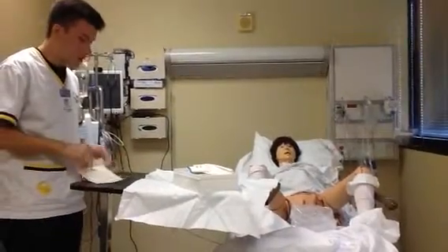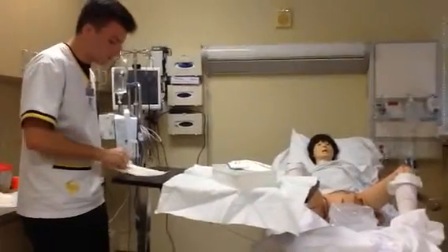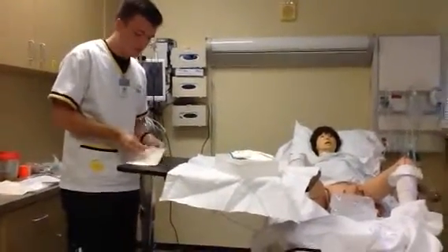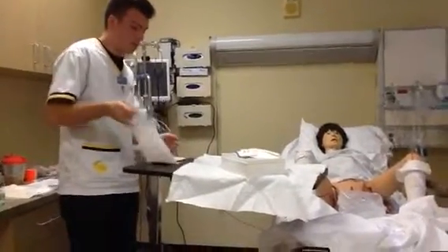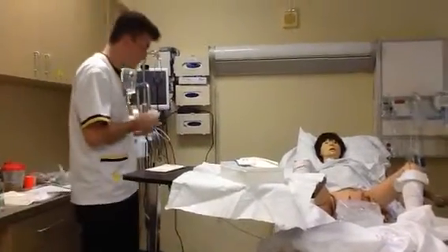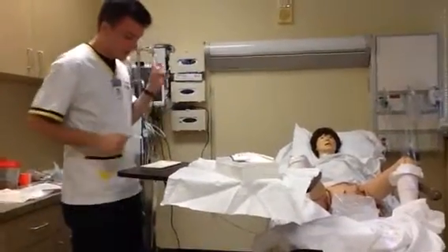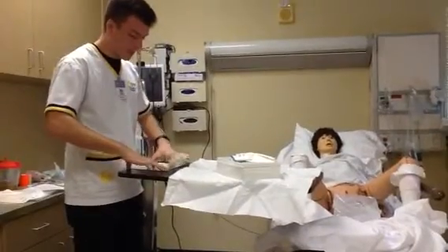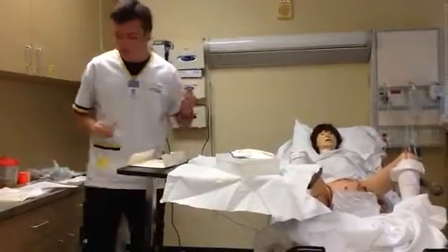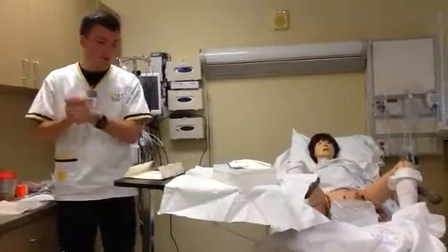So I'm going to keep the sterile field in front of me. Make sure that I have enough room to open the gloves without having anything touch my catheter. Okay. Since I just had my hand in the trash can, I'm actually going to do hand hygiene one more time, just to be extra cautious.